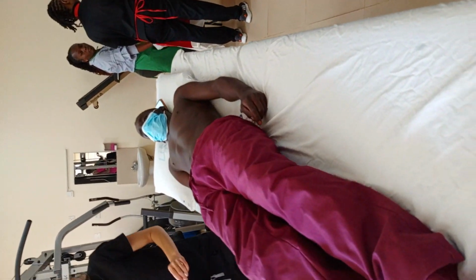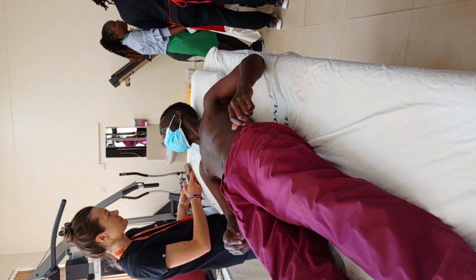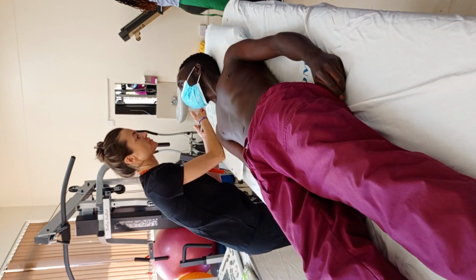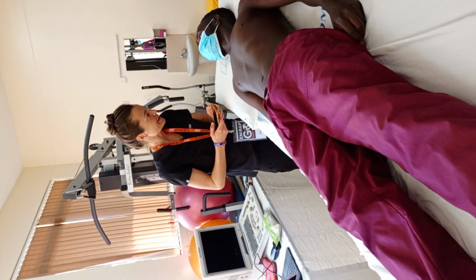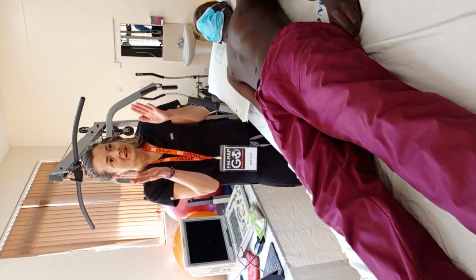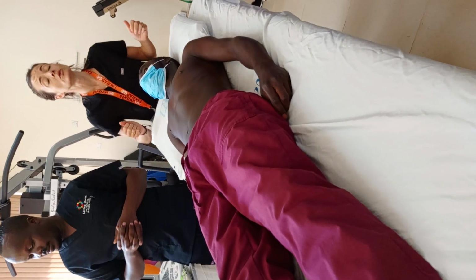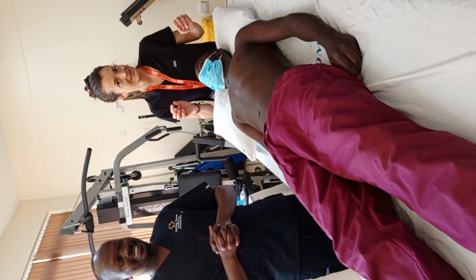Okay, so let me start my timer. What's your name? Chadwick? Chadwick. Did I say it right? Chadwick? Okay. Hi, thank you for helping me. Okay. Who has used an ultrasound before? Who's used an ultrasound before? A little bit? Yeah. A little bit?